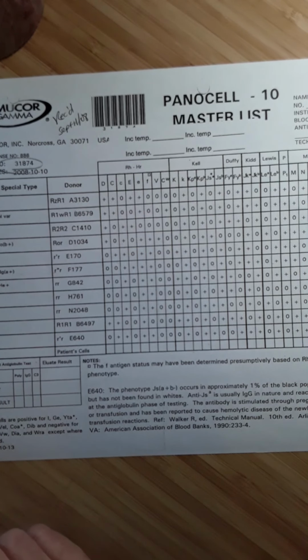My thought process is I want to set up another cell that is positive for big C and negative for D. The reason I want it to be negative for D is because I feel that my patient's plasma contains an anti-big D. So there's no point in setting up another D positive cell. I've got lots of D positive cells that reacted. I want to set up a D negative cell that's positive for C. And if it doesn't react, then I'll be putting a second slash on my C.